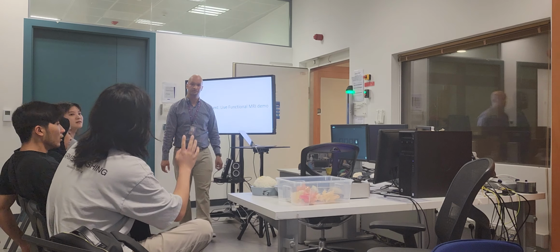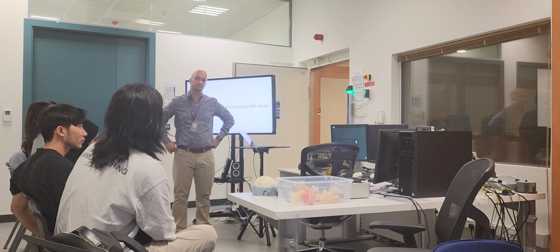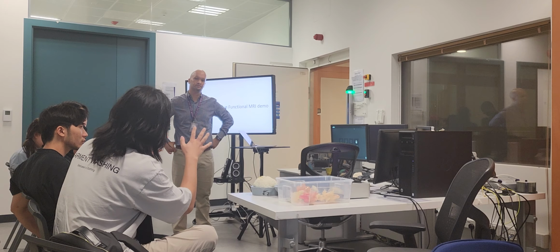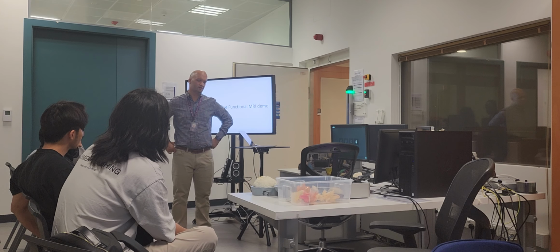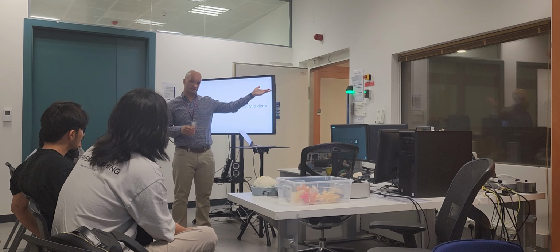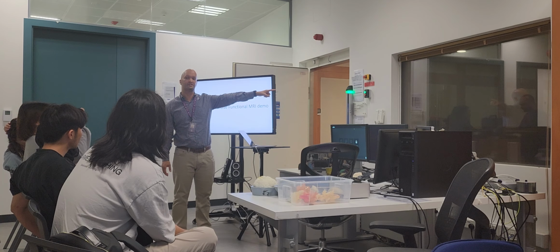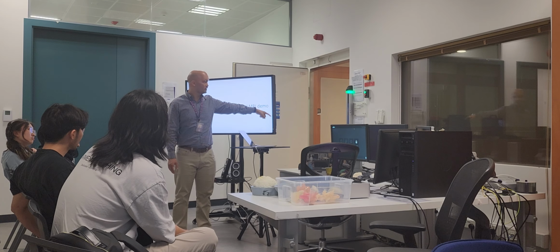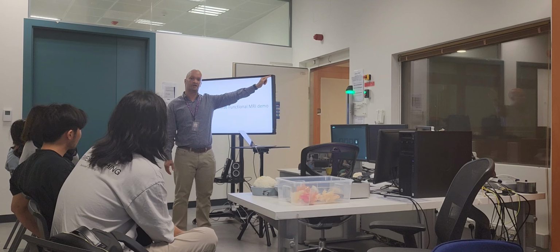Questions? Oh, I do have a question. If that thing attracting metal is a problem, like in MRI, like in NMR machines and in our ERB, we have it shielded. The shielding means that the fringe field doesn't spill too far. Yes, and this is a shielded machine. Inside, it's 3 Tesla. So it's 30,000 gauss. By this door, it's 5 gauss. So in only 3 meters, you go from 5 gauss to 30,000 gauss, and that's what the shielding does.